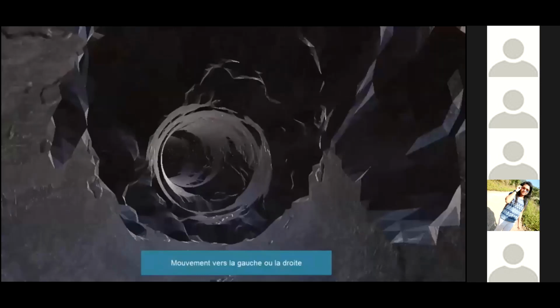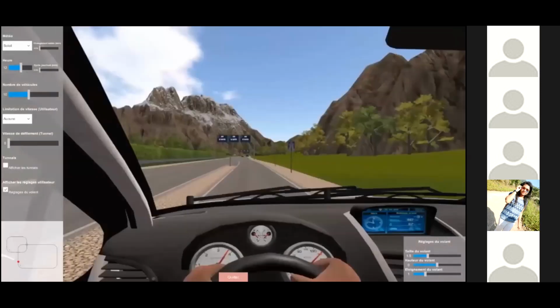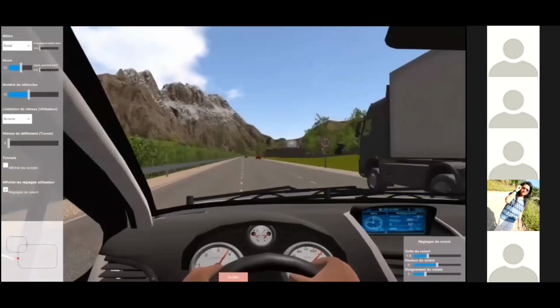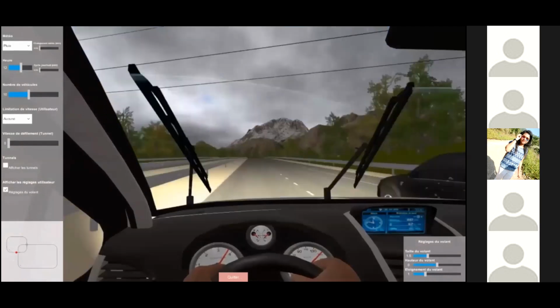That's for the motorist disorientation syndrome I told you about. It's patients who cannot drive on the highway anymore. They can drive normally in a city, in the streets, or on small roads, but not on a highway. So maybe I will talk about this another time, but those are very realistic conditions.